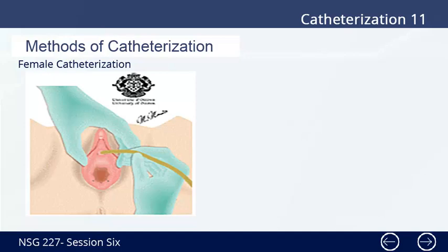14. If the catheter is to be indwelling, test the catheter balloon by connecting the syringe to the balloon port and inserting the correct amount of fluid, inflating the balloon. A balloon that does not inflate or that leaks needs to be replaced before insertion into the client. 15. If the balloon inflates properly, deflate it by removing fluid. Leave the syringe attached to the port. It prepares for the procedure while both hands are sterile.